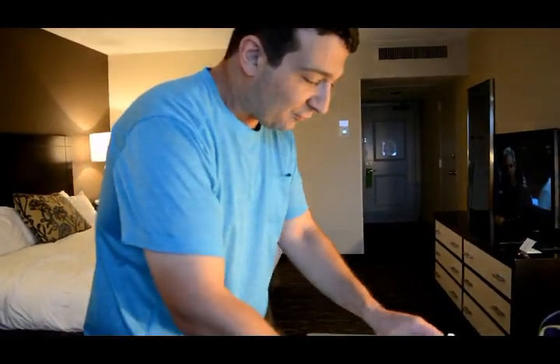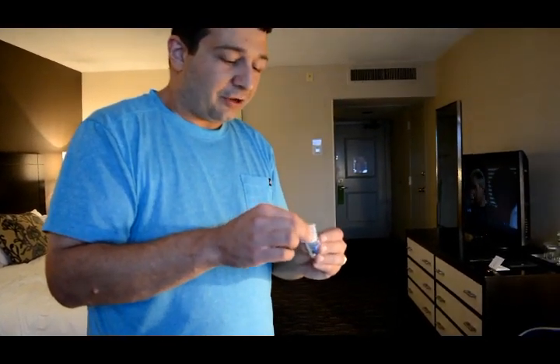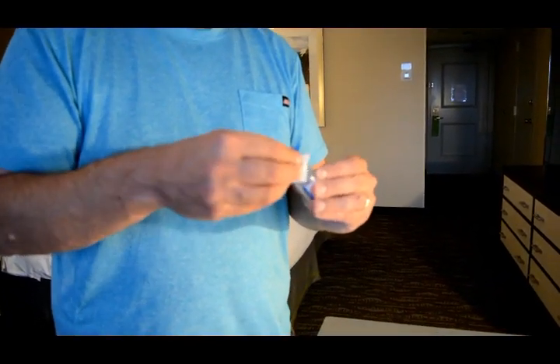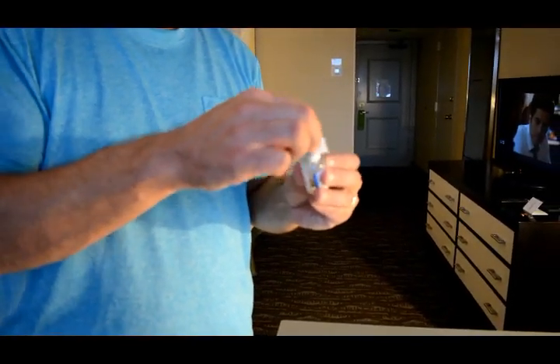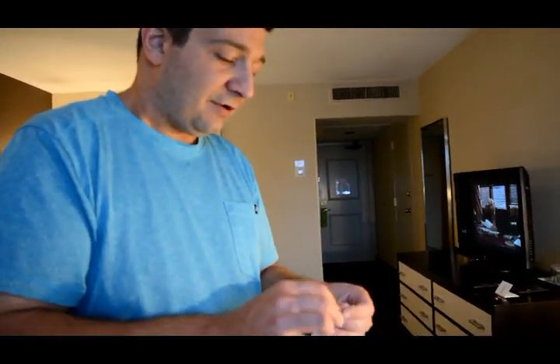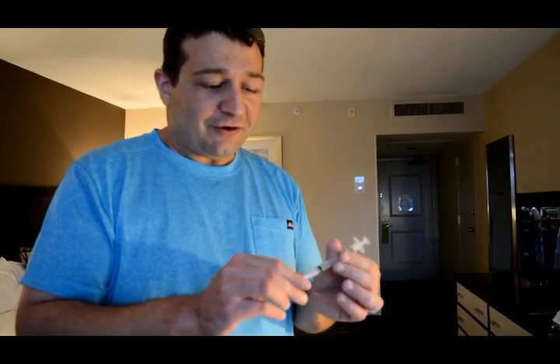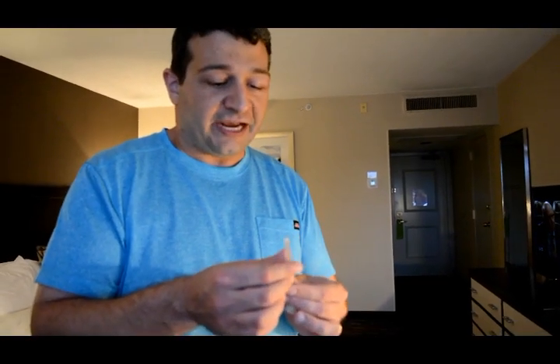First things first: take your progesterone oil and rub the top of it with an alcohol pad. If you're starting with a new vial, there's going to be a little metal cap on top — pop that off and then rub the top with the alcohol pad. Also, your hands should already have been washed and sterilized. Once you have your syringe out of the package, give it a little twist to make sure it's on tight and proper.